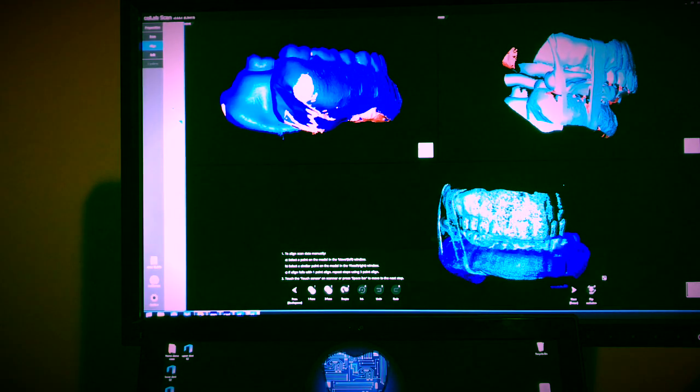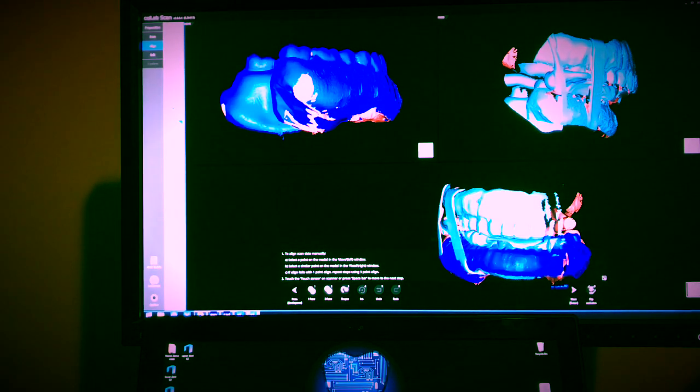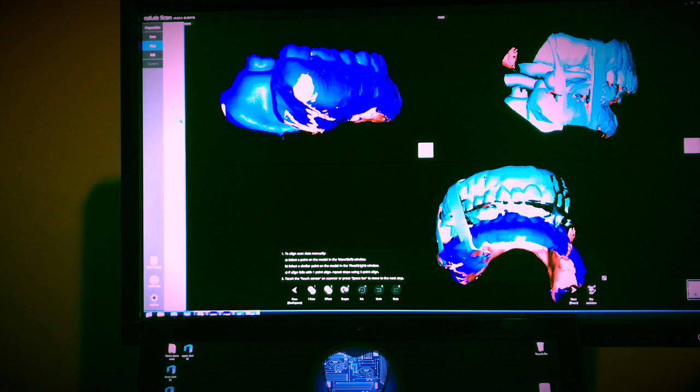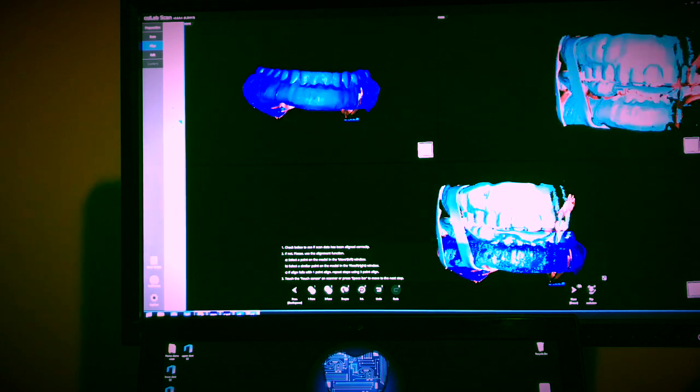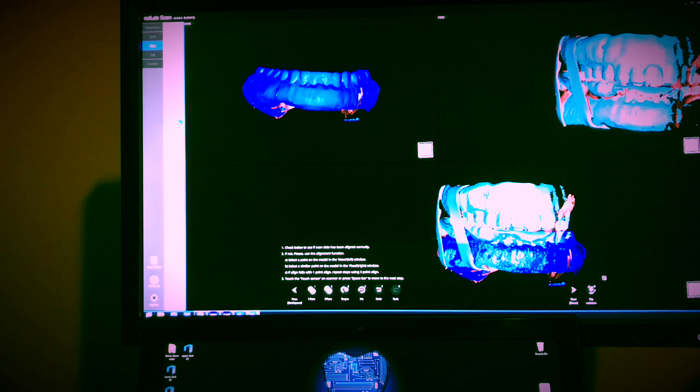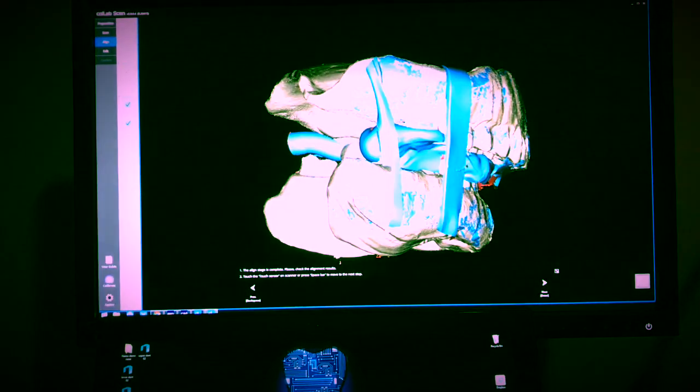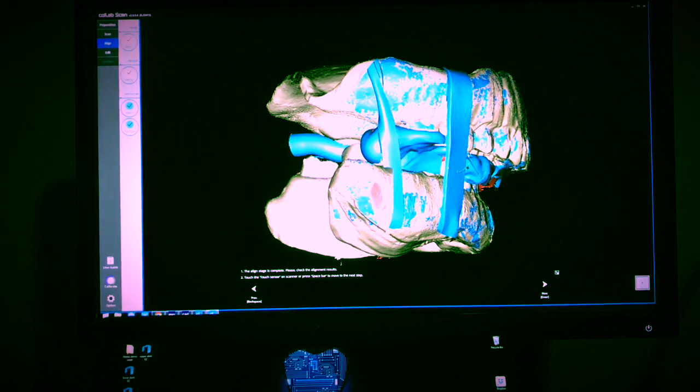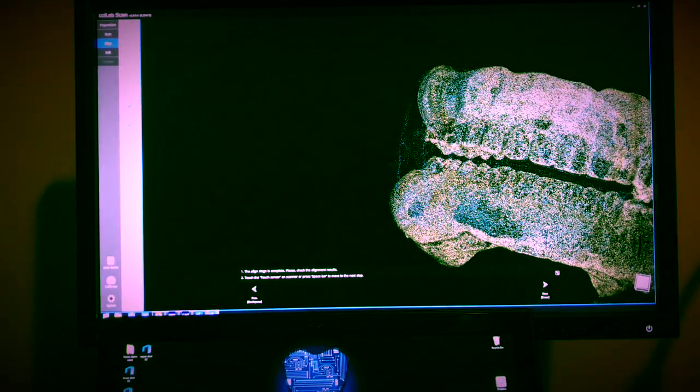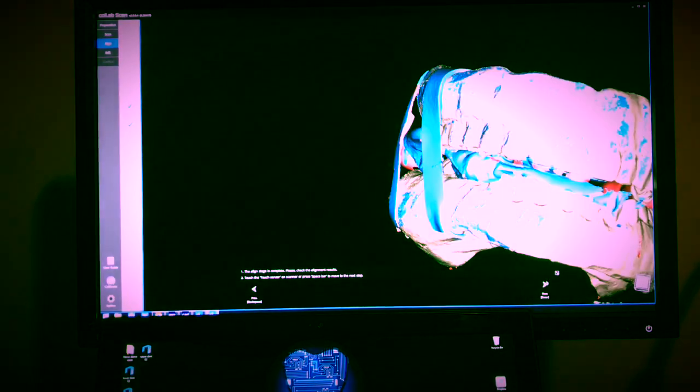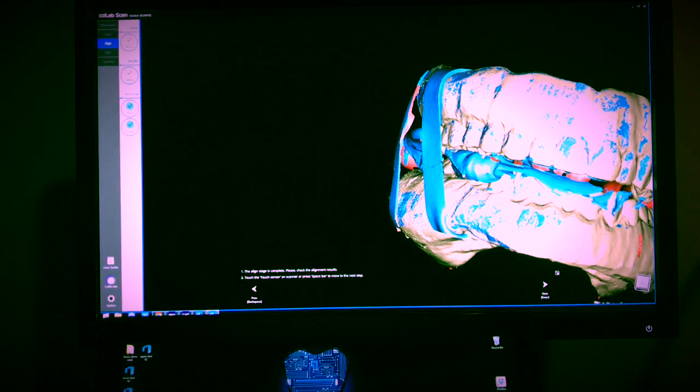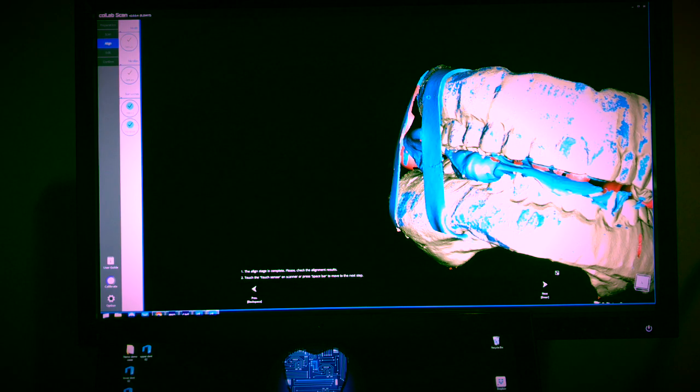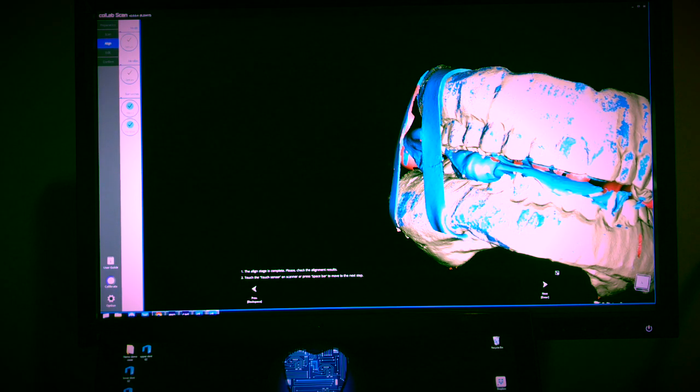That one is aligned already, so at this point what you really want to do is just follow the instructions on the screen. This is the alignment right there. It looks okay to me. I use some rubber bands to keep them in place with the bite record - that's why you see all this stuff right here.